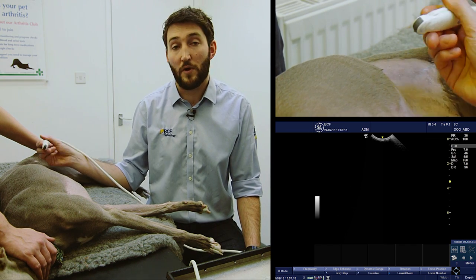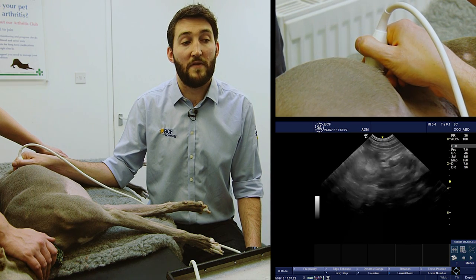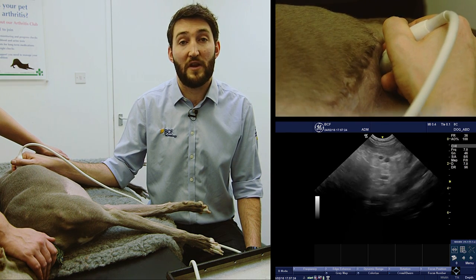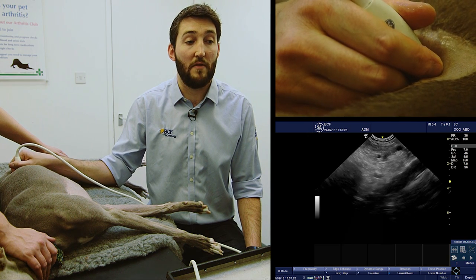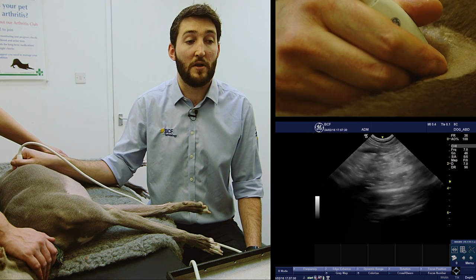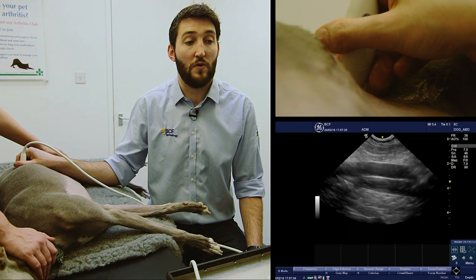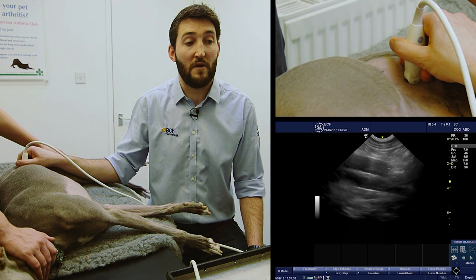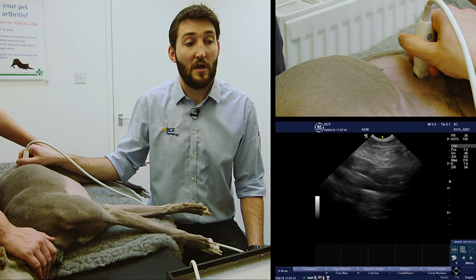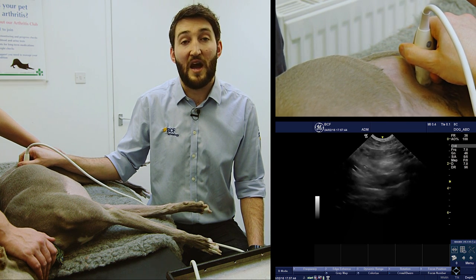So we'll do that one more time. We're going to start just caudal to the costal arch, find the kidney, fan off the dorsal aspect of the kidney, fan back ventrally until we pick up the vessel, and then we're going to slide caudally. The key is to keep watching the screen at all times. As we slide caudally, keep watching the screen making minor adjustments as we go, keeping those vessels in the image until eventually we end up at the bifurcation.